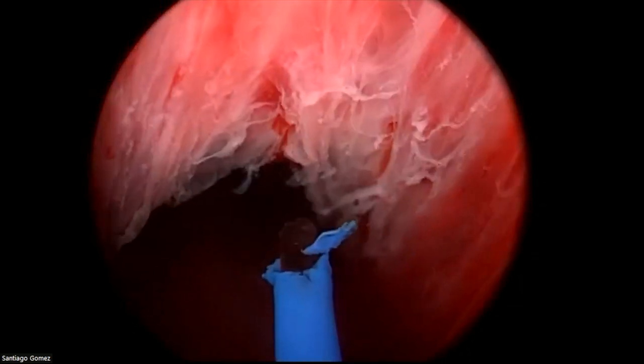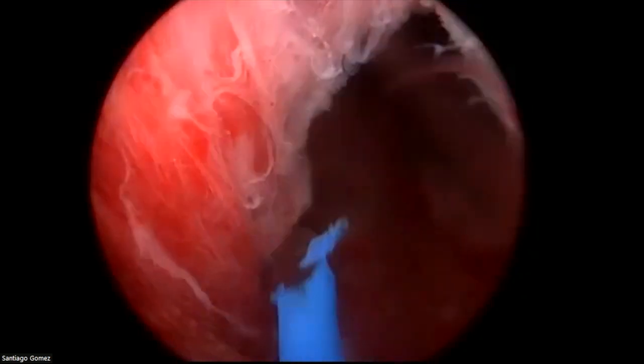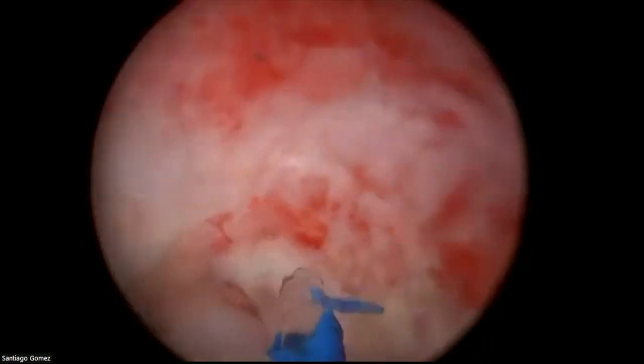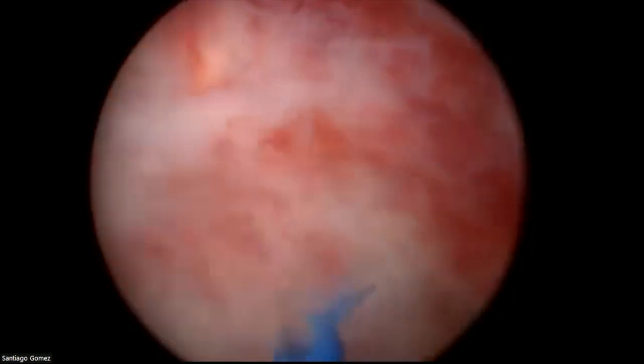You see, I come out and I see the sphincter a little bit shattered by the movements, the ischemia, but the mucosa is on the sphincter. There's still mucosa. So that will guarantee that the patient will be continent, perfectly continent. We can check hemostasis at the end to check that there's no bleeding.